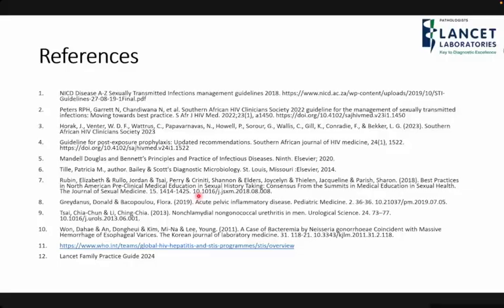So with a culture, after swabbing the patient, the swab has to be in the lab as soon as possible. How soon, I don't know, but we know that it's a fastidious organism. Some clinicians even ask for a plate, because Neisseria gonorrhoeae is fastidious, it doesn't even grow on our standard blood plate. It requires a chocolate agar, and that is supplemented with different things.